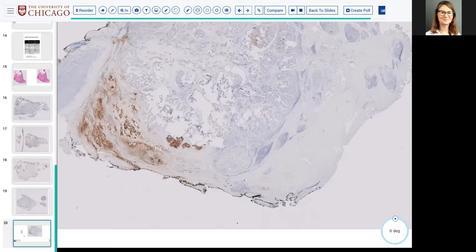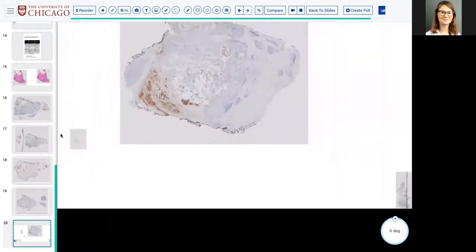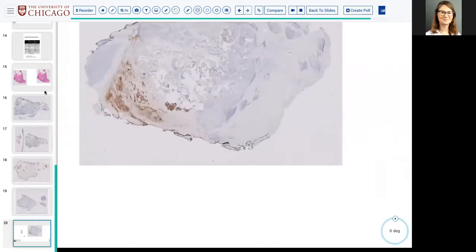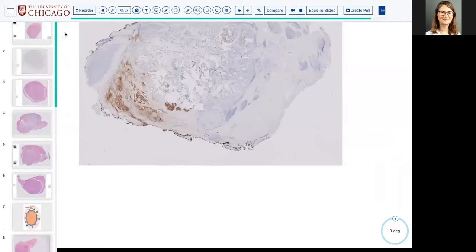So this was a nice example, I think, of a rare tumor that really mimicked a PTC, but has significant implications for patient treatment. So mucoepidermoid, I think, would be a little bit easier to diagnose, because you probably could see mucin and you're like, why is there mucin in here? And then you might go down the correct pathway, but you could also prove that with the MAML2 gene rearrangement.